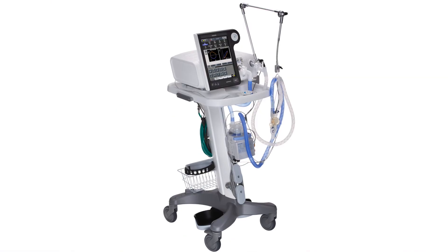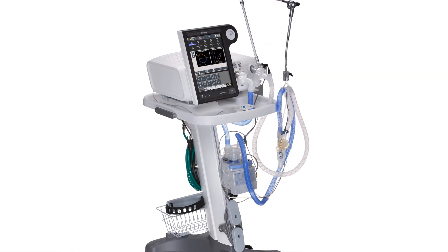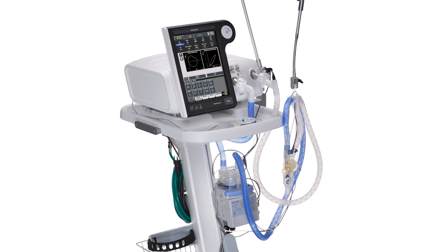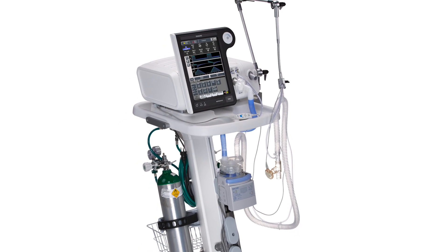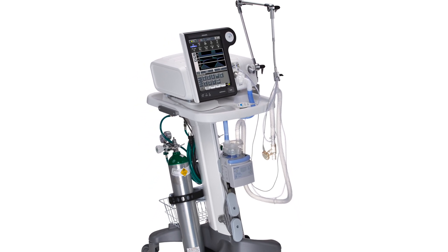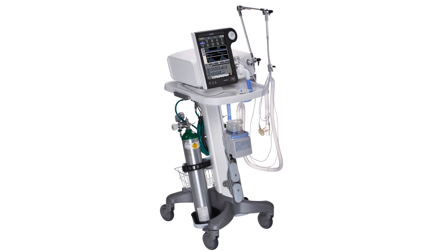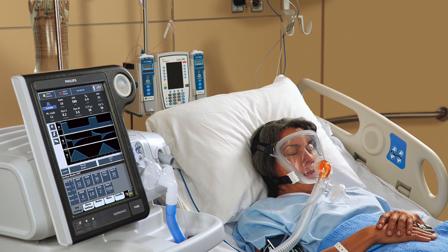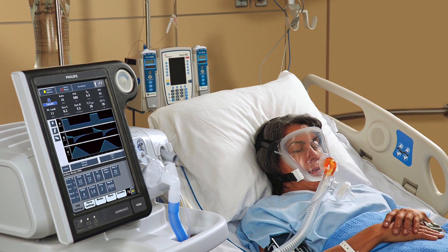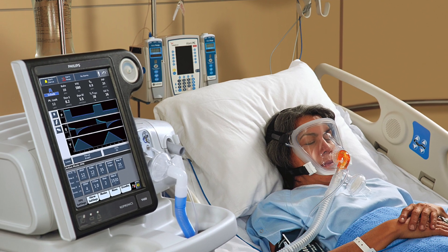We say the Philips Respironics V680 is two ventilators in one: a dual-limb, full-featured critical care invasive ventilator, and a single-limb BiPAP ventilator with our gold standard non-invasive ventilation technology. For ease of use, the configuration and setup is geared towards whichever type of ventilation you are performing. In non-invasive ventilation, we will set up the ventilator as a single-limb, open-circuit configuration, much like our BiPAP Vision, Focus, and V60 products.